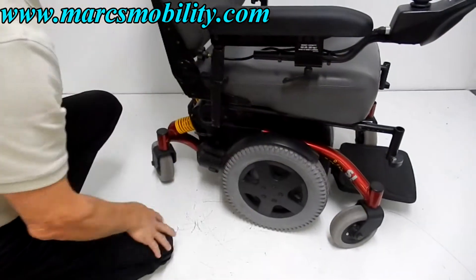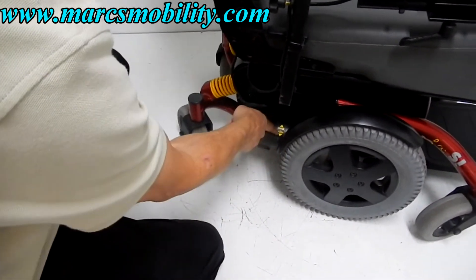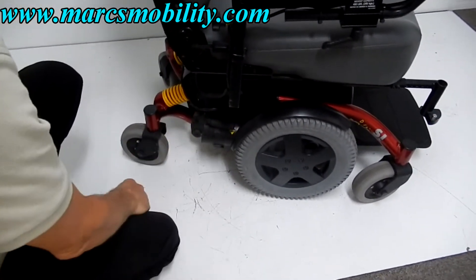Whenever you need to put this chair in neutral, you have a lever for each motor. Push the lever down — it says push for pushing and drive upward — and the chair is in neutral. You have to do both motors. This puts it back into gear.